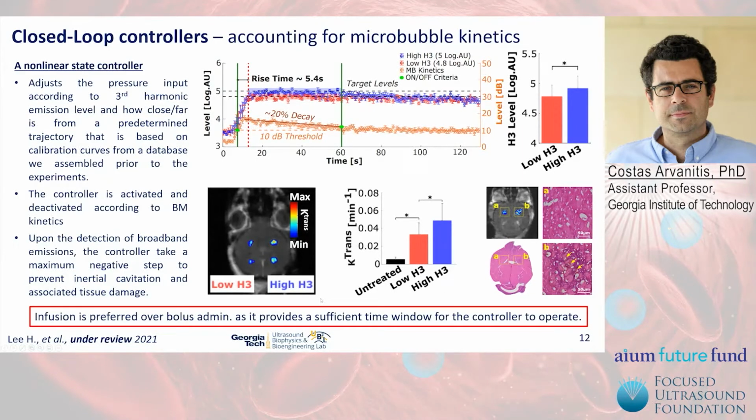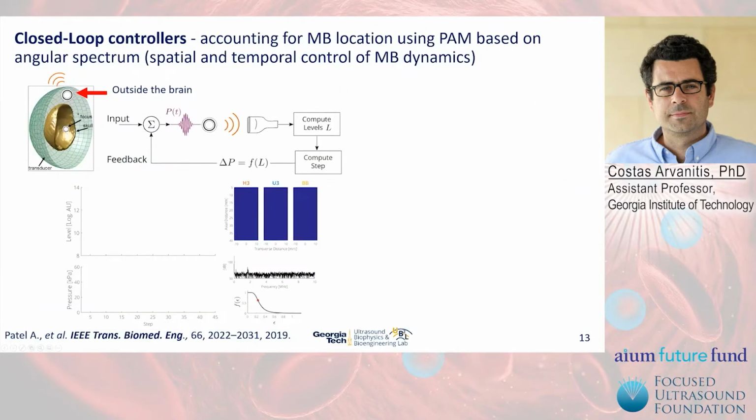And also infusion is the preferred method as it provides a sufficient time window for the controller to operate, in this case more than 40 seconds. So finally, what we were interested in, we employed a closed-loop controller that I mentioned before in the previous slide, using passive acoustic mapping based on the angular spectrum method.